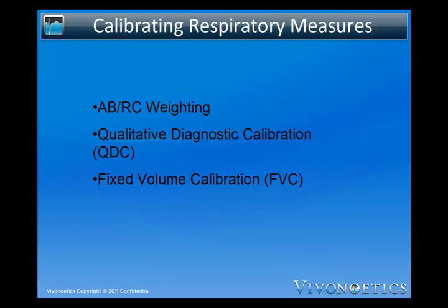Measurements of respiration using dual band IP technology requires additional signal processing and analysis to wholly exploit the value of these measurements. It is important to appropriately calibrate these measurements and assign relative weightings for the contribution of each respiratory compartment. There are several possible methods for calibrating dual band respiratory measurements.